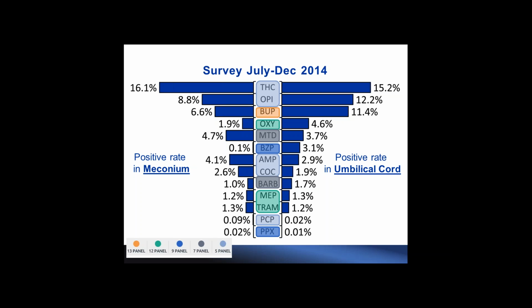If the samples are requested for the alcohol biomarkers, those are ethylglucuronides and fatty acid ethyl esters, they may take 1 extra day to release out the positive samples. And if there are positive results from the drug, it will be extra 2 days. So that would be the turnaround time. At least that turnaround time is from the time we receive the samples. I need to make that clear.